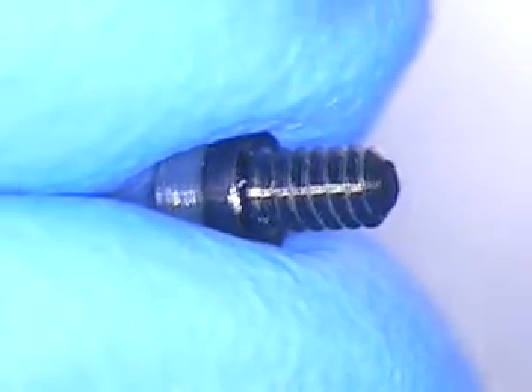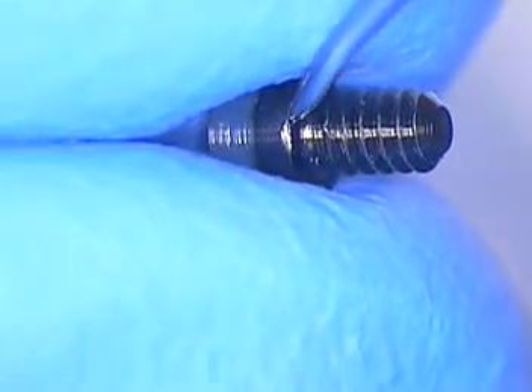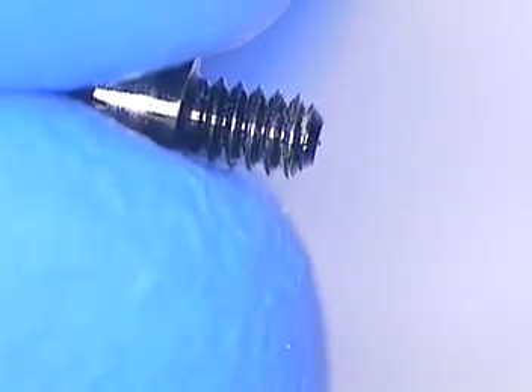No nicks on the screw — I checked this last night. I asked the lab for some new screws and we're good to go. The other thing you need to check: many times these screws are caked with wax, so you've got to be careful. Make sure your lab steams them every time they give them to you. And also the model work — you want to make sure nothing is transferred into your lab analogs.